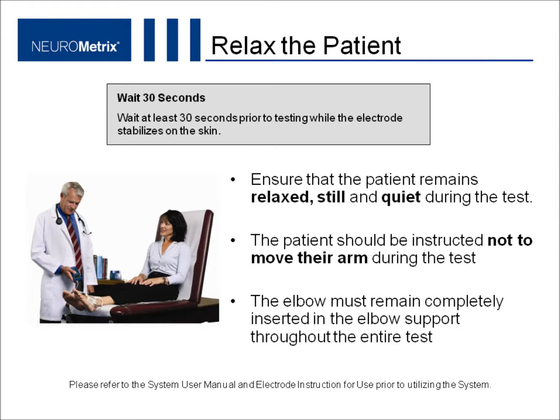Smooth the electrode and make sure it is adhered to the skin. Wait at least 30 seconds before proceeding with the test while the electrode stabilizes on the skin. Ensure the patient remains relaxed, still, and quiet during the test. The patient should also be instructed not to move their arm during the test. Ensure that the patient's elbow remains correctly positioned in the arm support throughout the study.